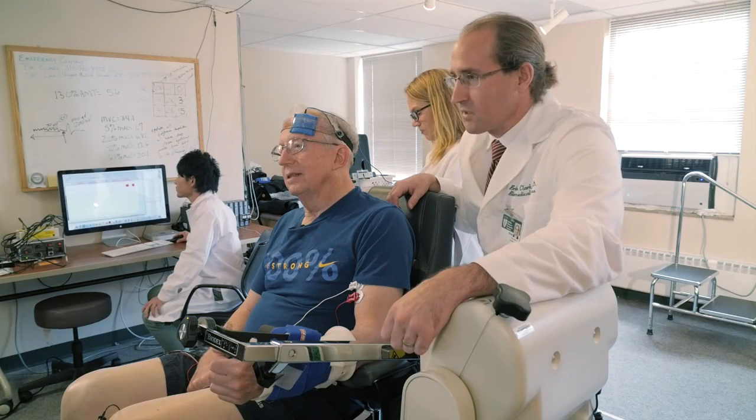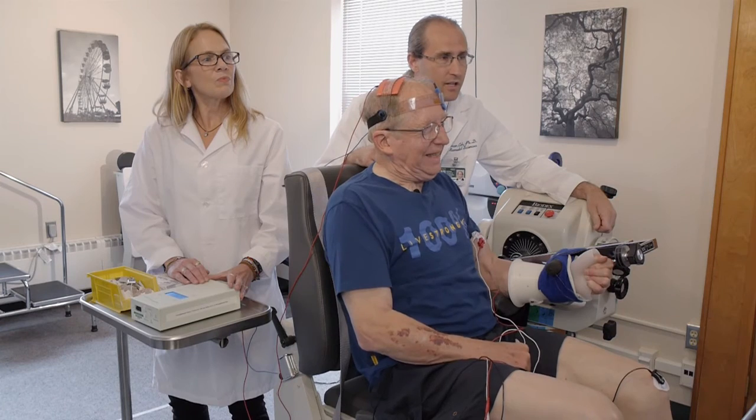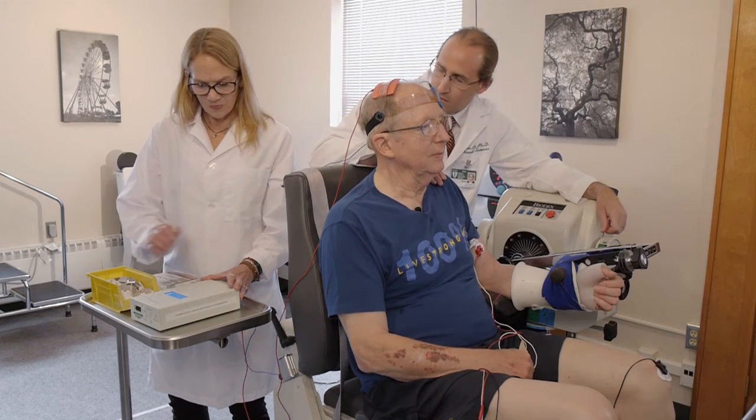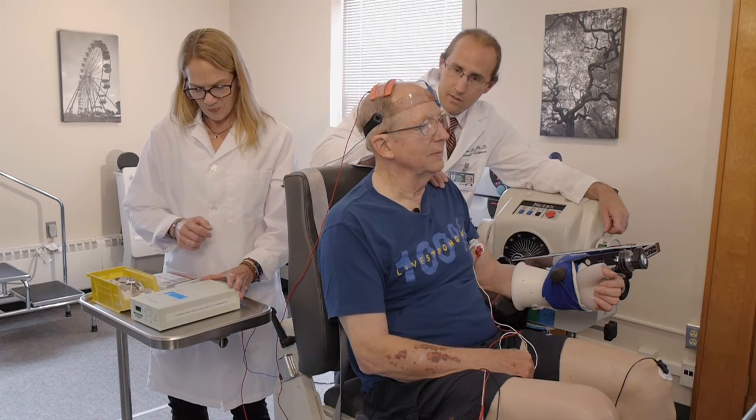Okay, Rob, here's the last one. On the count of three — one, two, three. Pull, pull, pull, pull, pull. And relax. Great. Leith is going to turn the device off now and the brain stimulation will end. And we're all done.